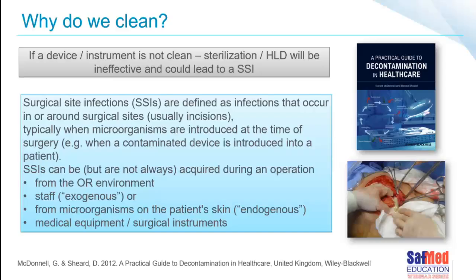The image on the right was in fact an outbreak of infections that occurred a few years ago relating to laparoscopic surgery, and it was in fact a mycobacterium infection where numerous patients were affected. A horrendous outbreak, and as you can imagine, none of us want our patients coming back with pus.